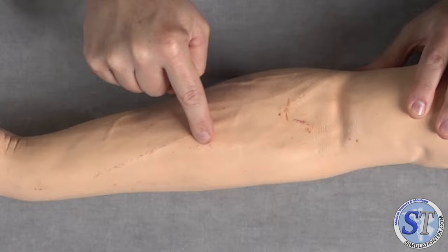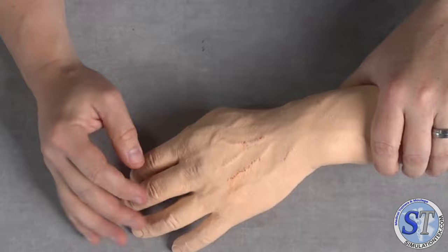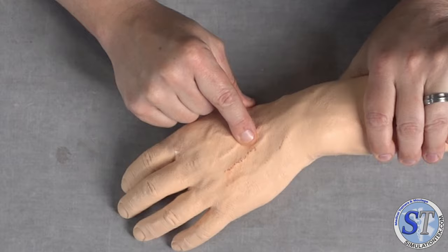We're going to look here, and it's got some areas where it's been cannulated down here, things like that. It's been stuck up quite a few times. If we look at the back of the hand there, it's got a few. But if I clean it real well, I would probably keep this in service. But we'll talk about how we want to do all of that. The first thing we want to do is take the skins off so that we can look under it and see.